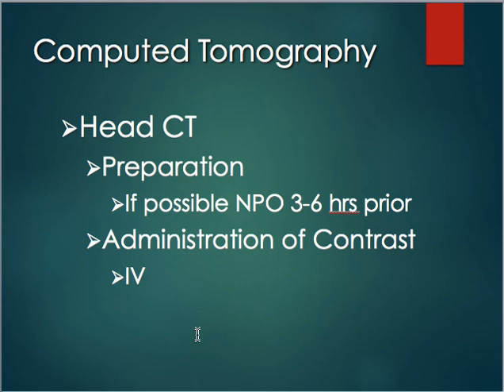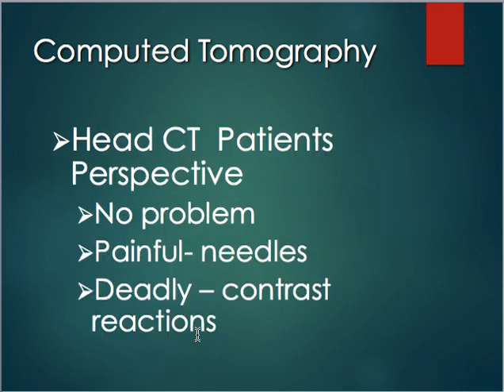Now, that's not going to be a determining factor. Obviously, if we have trauma situations and we have to give the patient contrast, we're going to give it to them whether they've been NPO or not. We're not going to make them wait 3 to 6 hours if it's an emergency situation. We're just going to go ahead and give them the contrast and scan it because the benefit outweighs the risk. Okay, worst case scenario, the patient might puke, but if they just were in a car accident or we're worried that they might have had a stroke, them puking is not that big of a deal in the grand scheme of things, right? We want to hurry up and get that scan done.